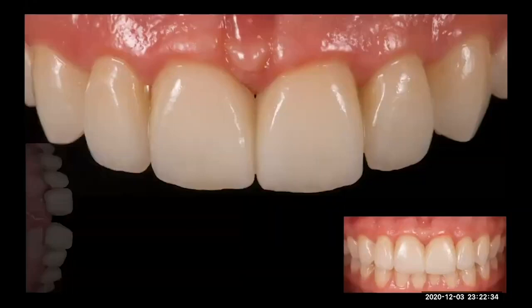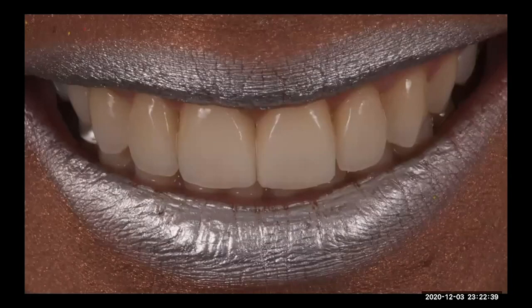This is a week control. This is an 8 months control. You can see the movement in the teeth, the individualization between each restoration. We are always focusing on nice gingival contours, nice incisal embrasures, and trying to make everything more natural, not like piano keys or something in one color. That is really, in this market in America, everybody wants white colors.